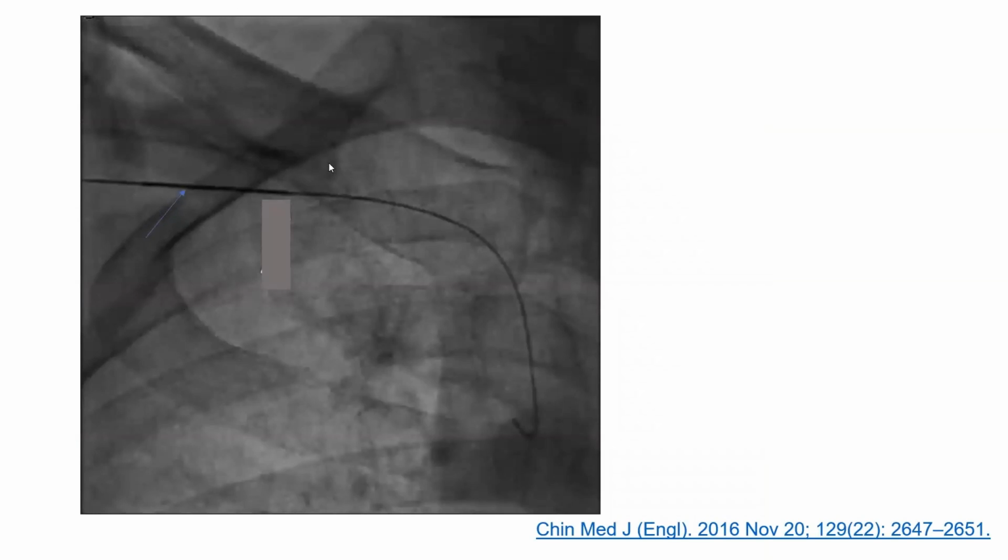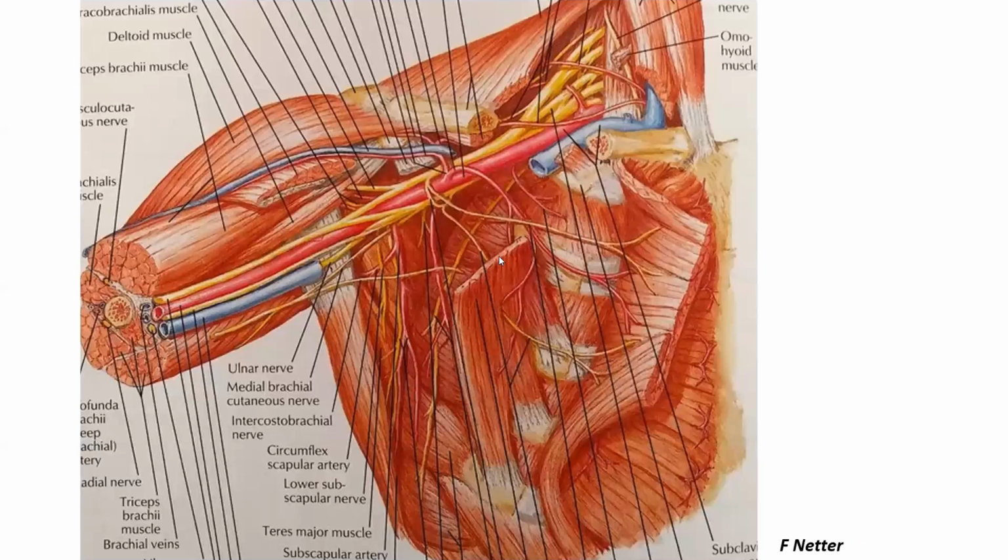This is the first rib, this is the clavicle. They aim for that outer and superior border. They are aiming for the axillary vein, and they definitely try to stay out of the clavicle. So by today's standard, we try to access the axillary vessels, whether artery or veins. So the second big anatomical idea is, what is the relationship between the axillary artery versus the axillary vein? The axillary artery is more posterior to the vein, is deeper than the vein, and it's more superior to the vein.